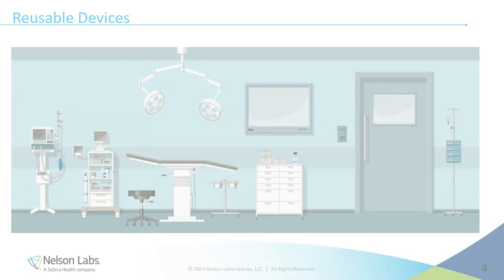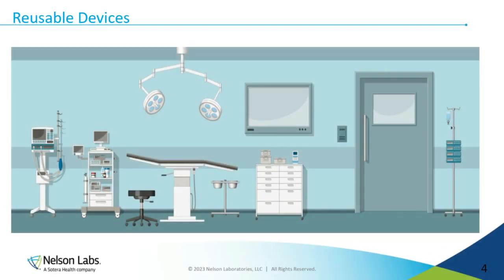Oops, I went too far, I apologize. When I talk about reusable devices, we're also talking about devices that are in the healthcare facility, right? Now you'll see these orange spots on the slide deck, where you'll see these devices are often utilized as healthcare practices, decontamination processes, right? You'll have AORN or SGNA or organizations that have written good hospital practices for cleaning and disinfecting instruments.